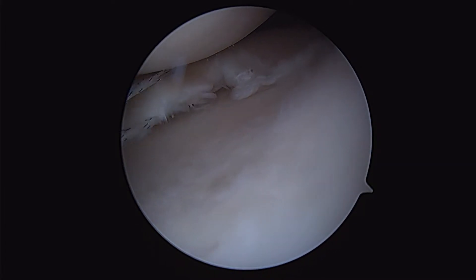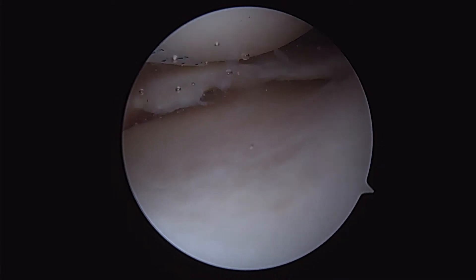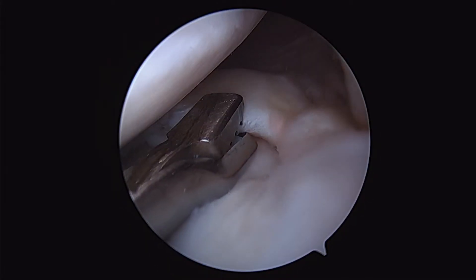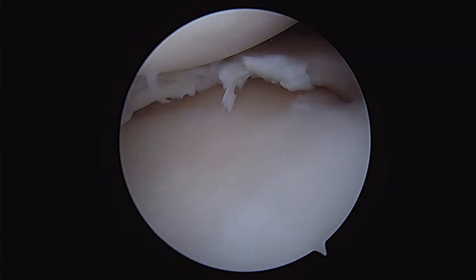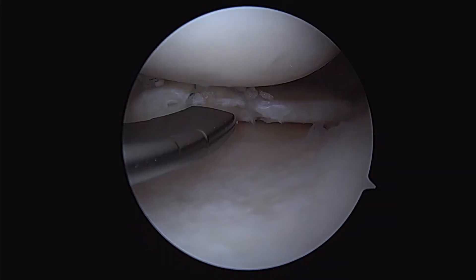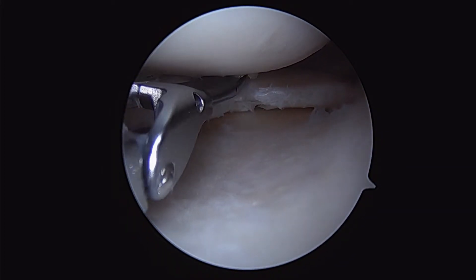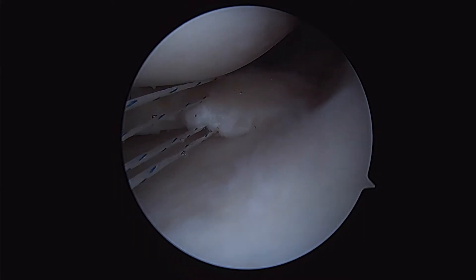Next, I'll trim off portions of the meniscus that I do not feel are viable or will not heal very well. You can see that nice radial split as I'm pulling on it. Typically if your surgeon is trimming out the meniscus, this is how they do that — they'll bite smaller pieces and then vacuum out the debris. But the literature shows that if you take out the meniscus you will become arthritic, so the idea is preserving as much meniscus as possible.